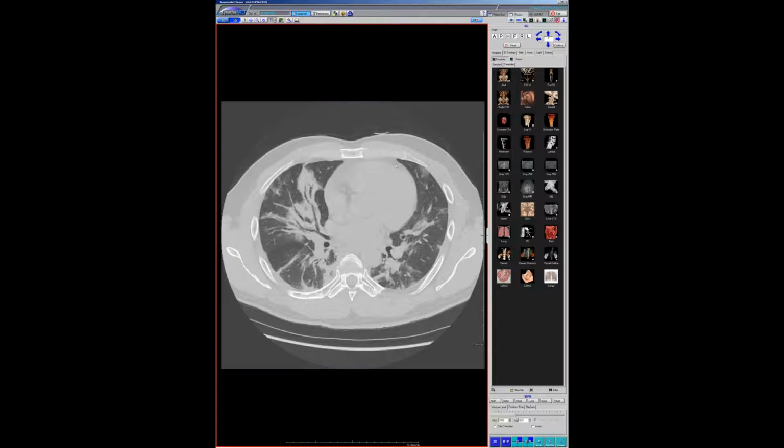I really like this example, and I think this is one of the big complaints I have with some of the literature that's coming out so rapidly, like the recent one comparing COVID to other viral pneumonias. It's an artificial population, because especially with us, you're going to be comparing COVID to patients on Pembro who have a drug reaction, and your specificity is going to be a coin flip if you put this patient up against one on Pembro with a drug reaction causing organizing pneumonia.